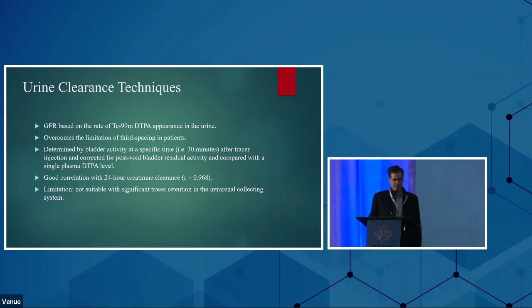However, if the patient has hydronephrosis or any significant tracer retention, you could have some inaccuracy in that situation.